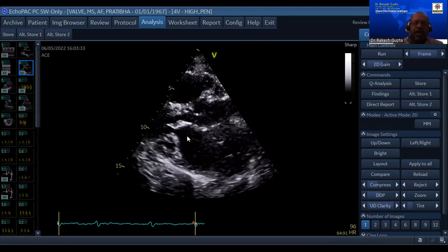And why does this doming happen? Because of thickening, commissural fusion. What do commissural fusion and thickening have to do with the doming? Commissural fusion will reduce the space, not cause the doming. Sir, what happens is that a huge amount of blood accumulates and it cannot go through the valve. No. You know why this doming happens?